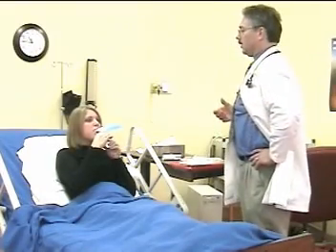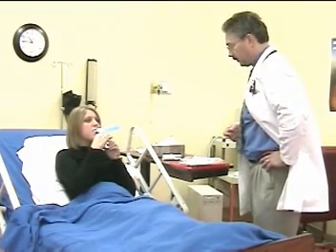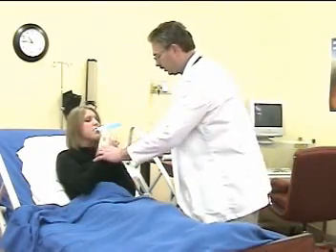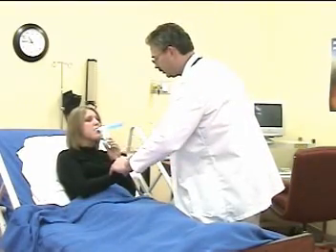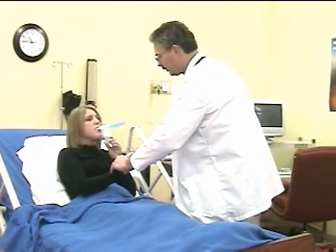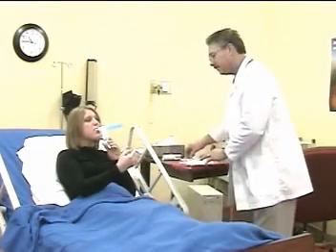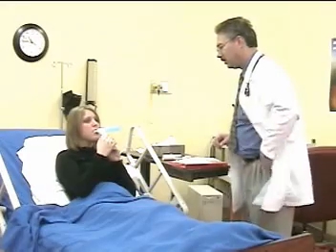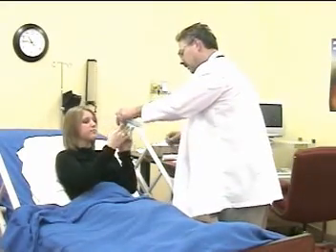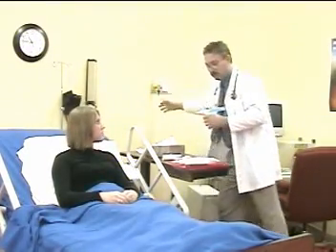Take a deep breath in, pause a second, let it out, and normal easy breathing. The therapist monitors the patient's pulse and respiratory rate during therapy. Okay, it sounds like the therapy and the medication has run out now, so we will finish the treatment.